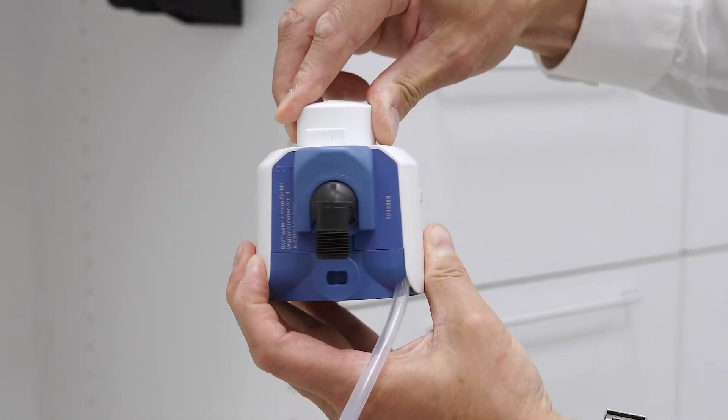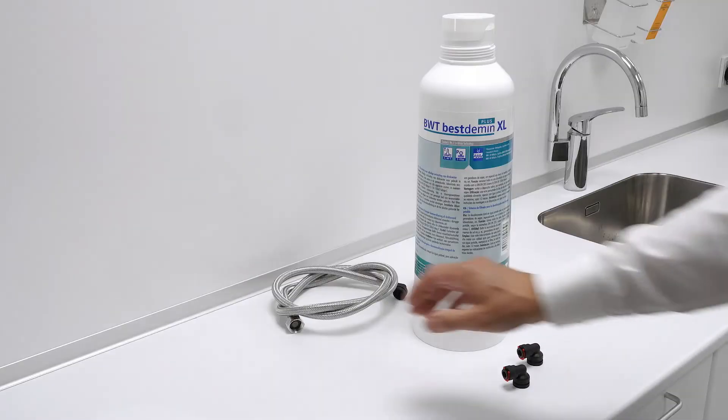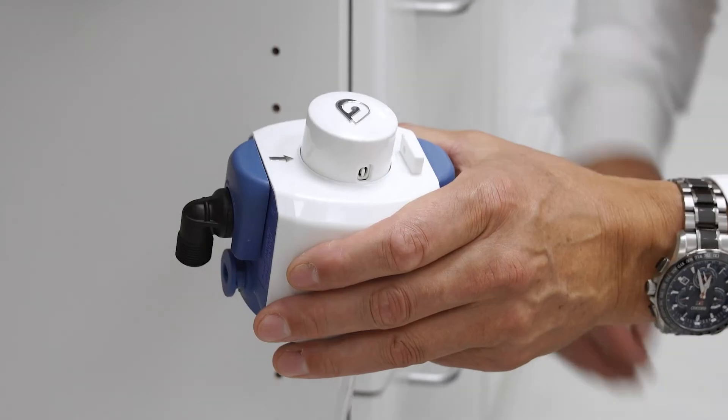Set the filter head to position zero. The access hose must be mounted in the direction of the arrow.